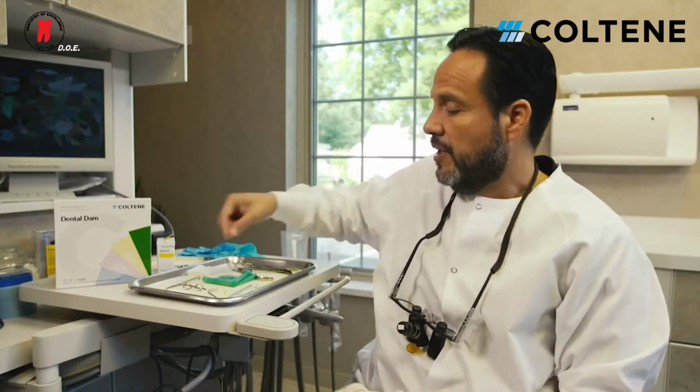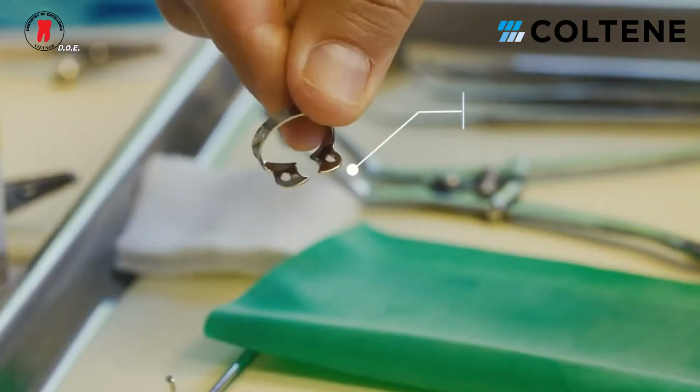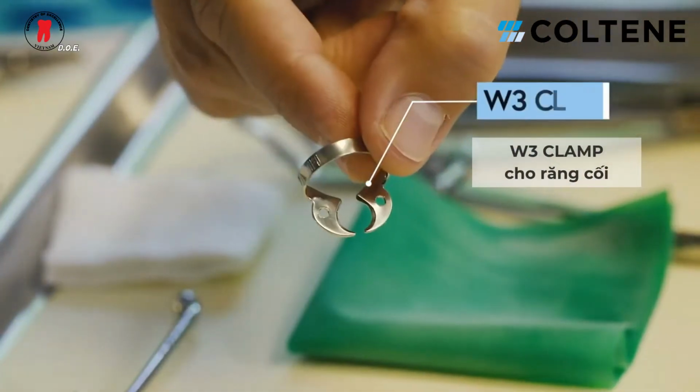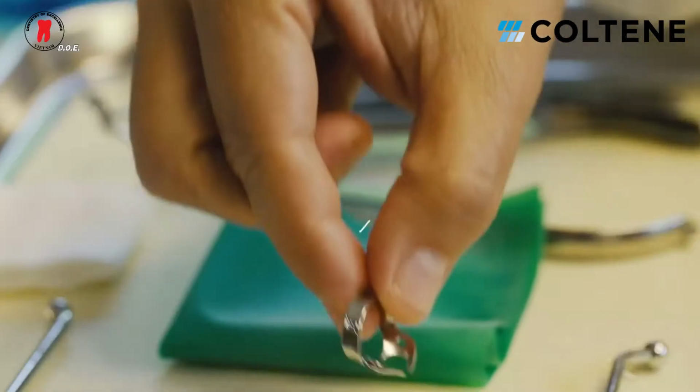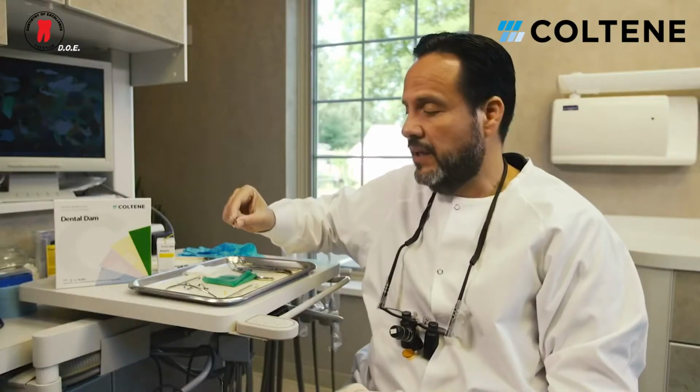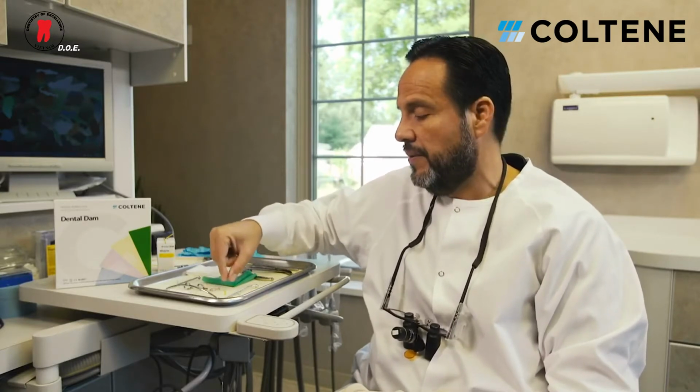We're going to start reviewing our basic armamentarium for a rubber dam isolation. I'm going to start out with showing you the W2 clamp for premolars, the W3 clamp for molars, and the W8A clamp that I normally use for molars that are slightly broken down and that I don't have a lot of room for me to engage the jaws of the clamp towards the molar.